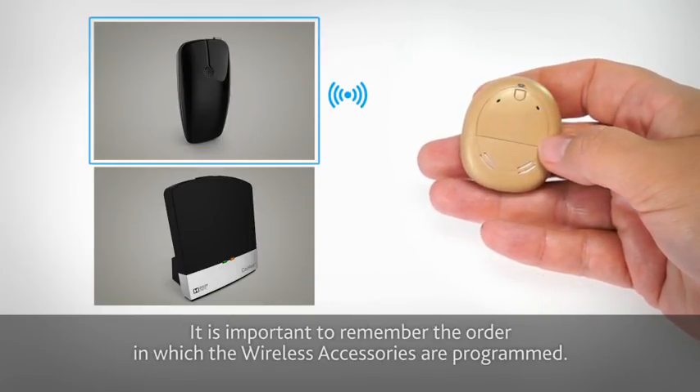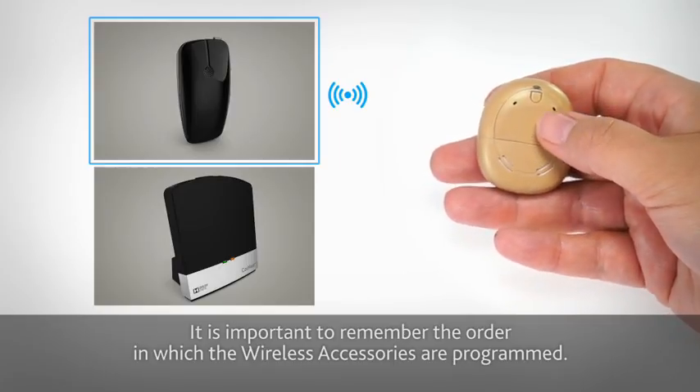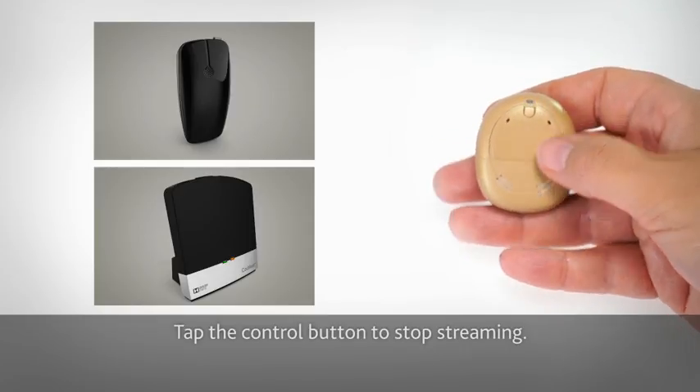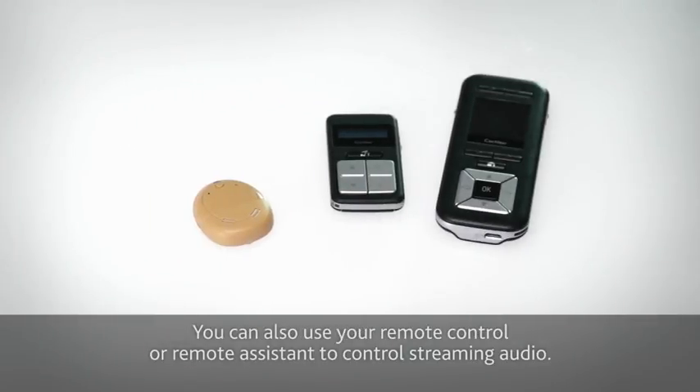It's important to remember the order in which the wireless accessories are programmed. Tap the control button to stop streaming. You can also use your remote control or remote assistant to control streaming audio.